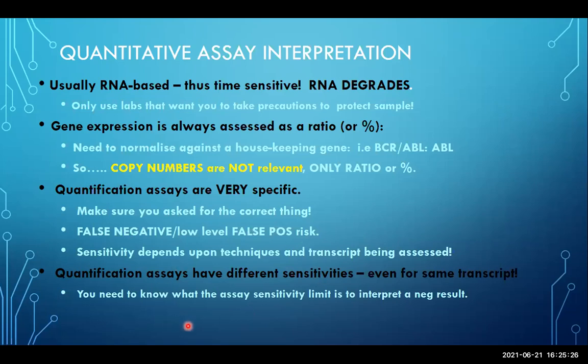And as I've said here, quantification assays have different sensitivities, even for the same transcript, depending on what assay you're using. So you need to know what the assay sensitivity limit is of a test to be able to interpret it as a negative result.